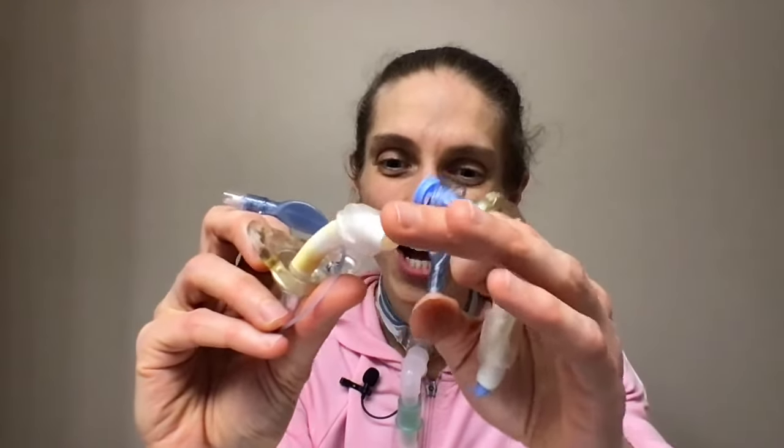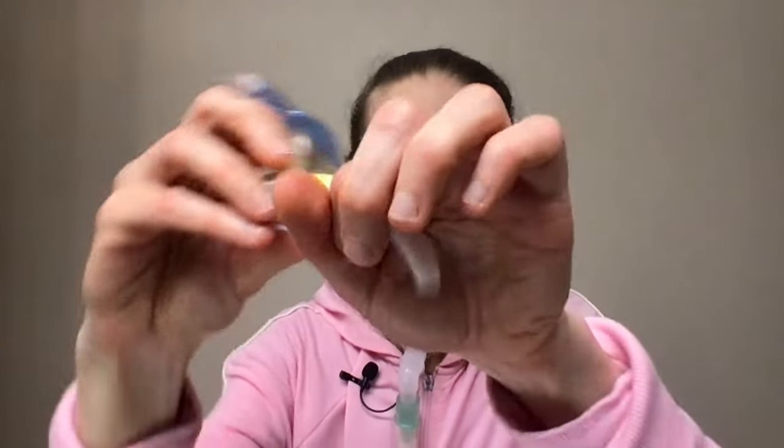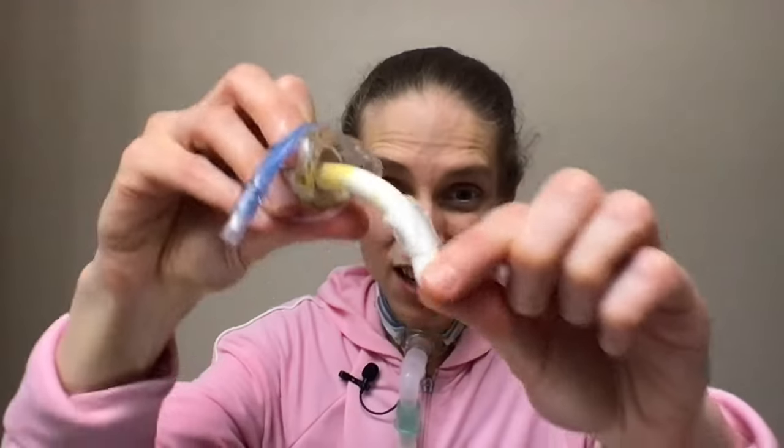Let me show you what happens when you do not use an obturator. Here is a tracheostomy tube without the obturator. You see, it has this edge on the end, and this edge can get stuck in your trachea. So you're trying to insert this, and this edge will get stuck, and you will not be able to get it inside, or you'll have to use a lot of force, and that can cause damage to your trachea, or it can even rip your tracheostomy. This will cause a lot of bleeding and pain, and it should not be painful to insert the tracheostomy tube.